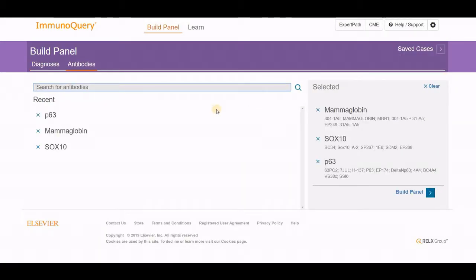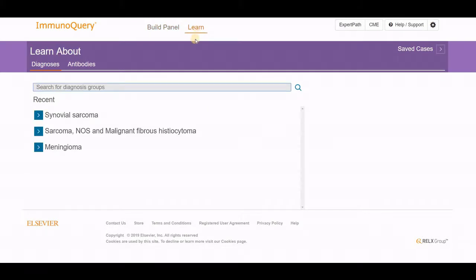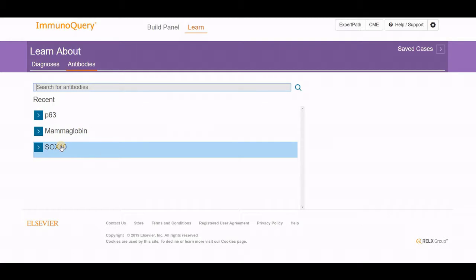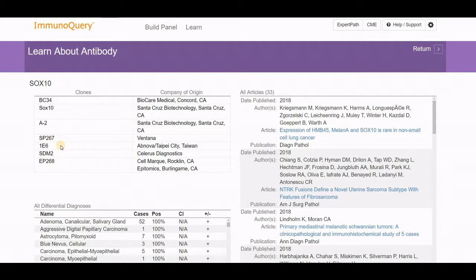One of the other things you may want to utilize is the learn function. The learn function allows you to say, what if I want to learn a little bit more? I just tested these three antibodies. Let me learn more about SOX10. When you push that function, it brings up the category. It tells you all the major manufacturers, all the various clones, so you know exactly what you're getting a result for in your lab and how to interpret those results. These are the most common clones out there.